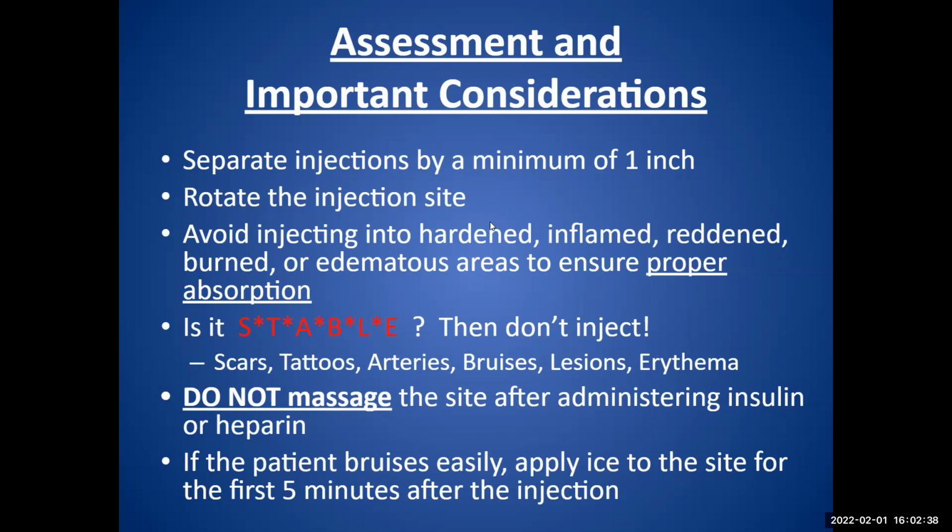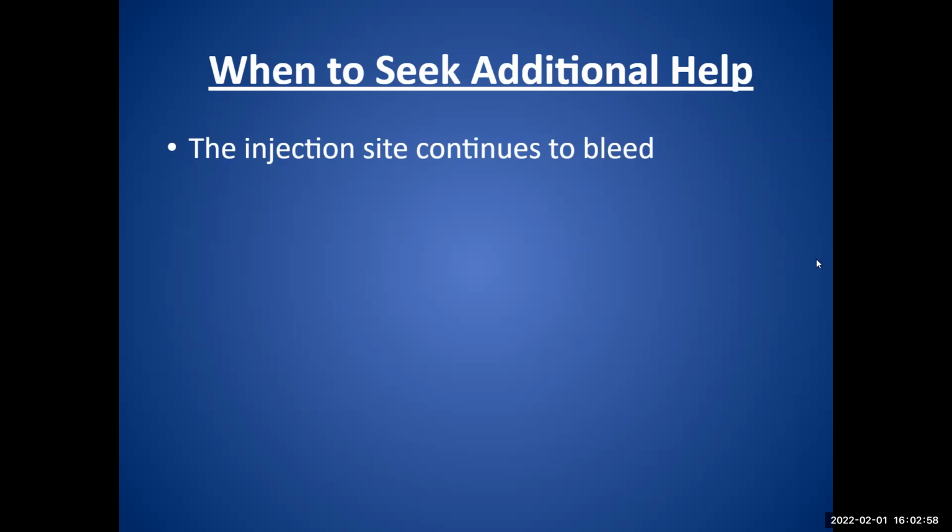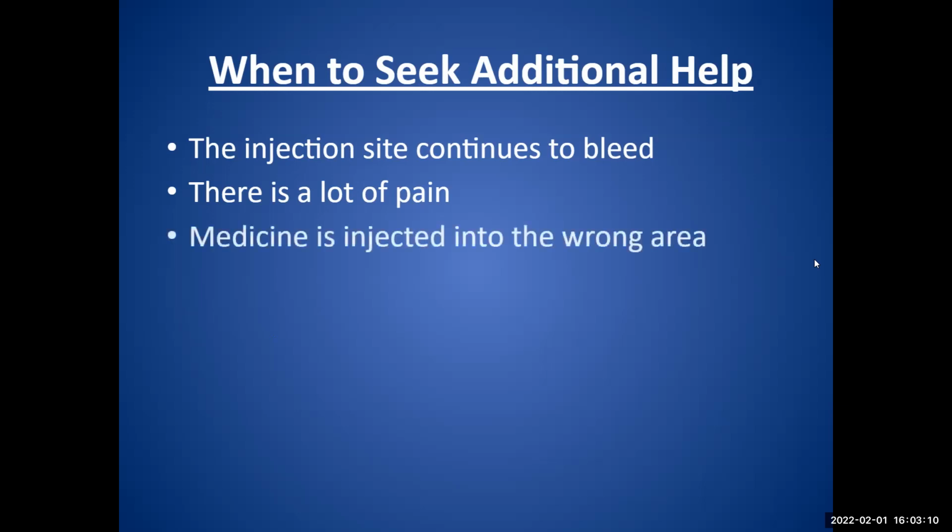Never massage after administering insulin or heparin. And if the patient bruises easily, apply ice to the site for 5 minutes after injecting, especially with patients who might be on anticoagulants. Okay. Go get help if after administering the injection the site continues to bleed and you can't control the bleeding, or if the patient's having a lot of pain, right? There's discomfort, but they should not be in pain.